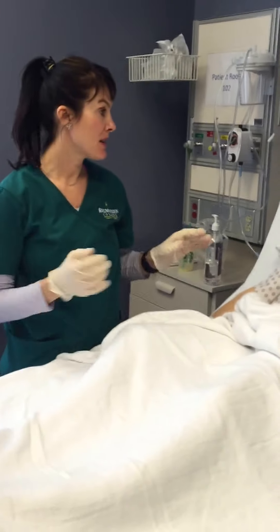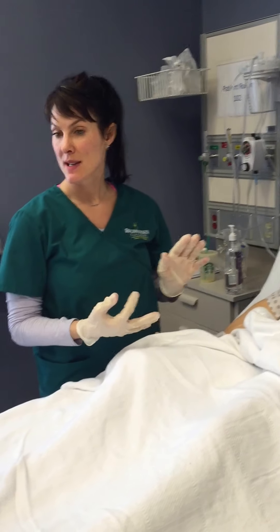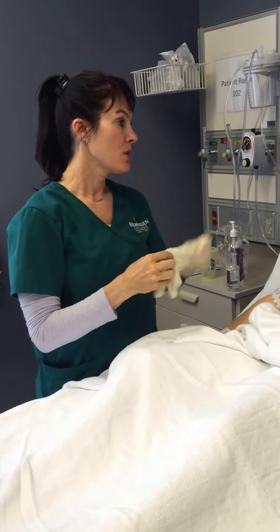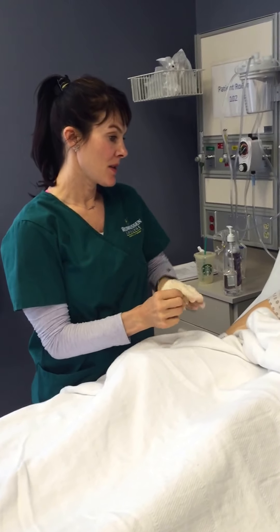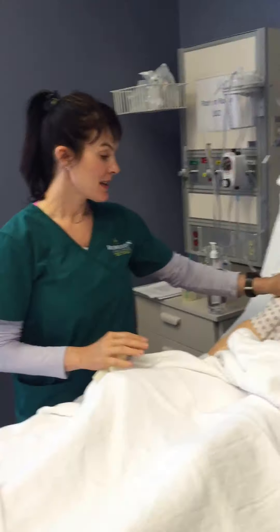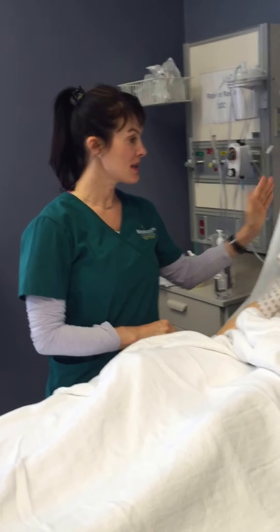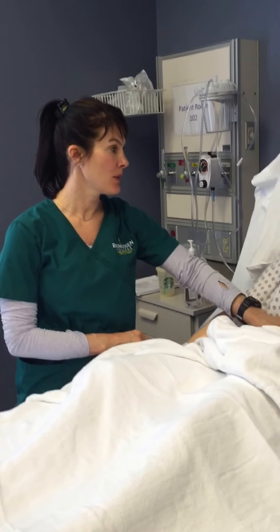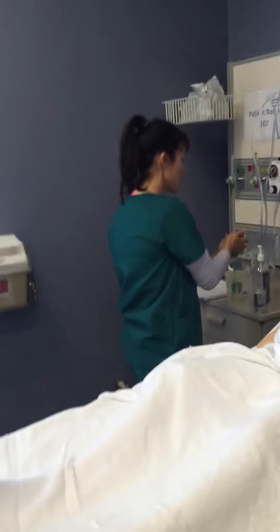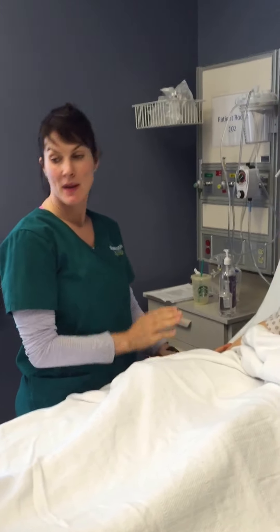I'm going to clean up and document my findings. I would document orientation — person, place — how much I administered, the G-tube, and any gastric contents pulled out. I would lower the bed and make sure the patient stays in High Fowler's for the next 30 minutes to help digest the food. I'll perform hand hygiene. If you need anything else, I'm Laura, I'm your nurse, and I'd be happy to help you.